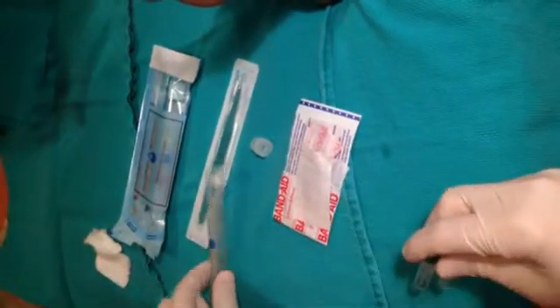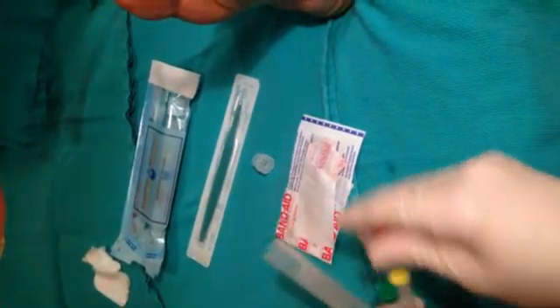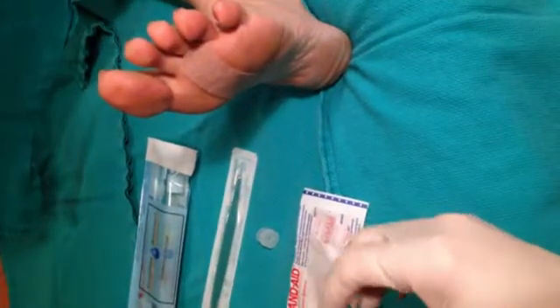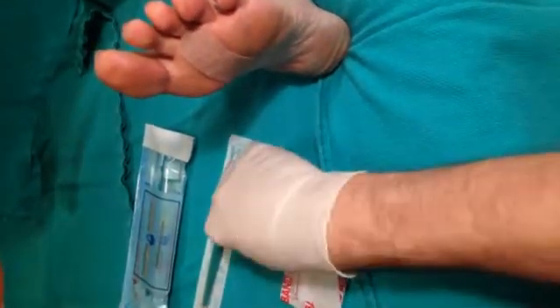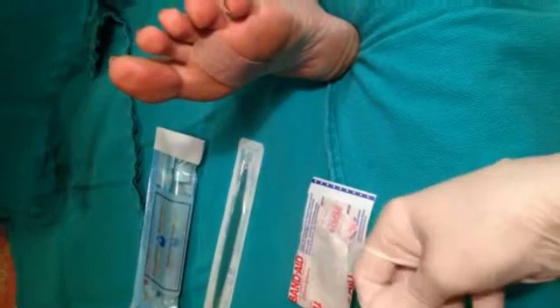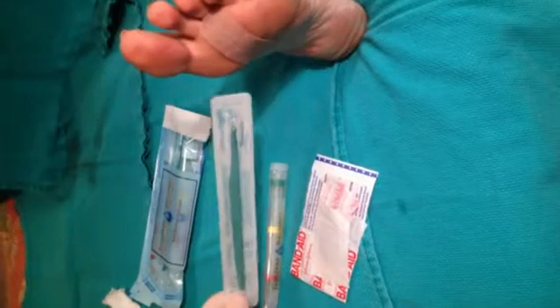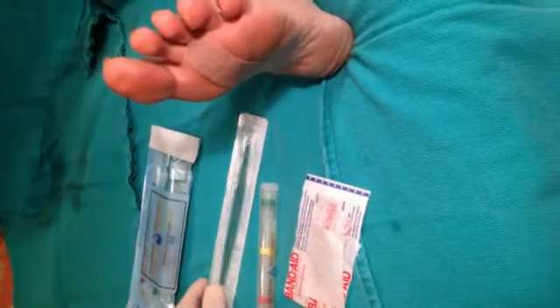The solutions after 48 hours need to be disposed of because they will no longer have the potency necessary due to water uptake. We are recapping and storing them, and then we will have the curette tomorrow for the actual debridement to take place.